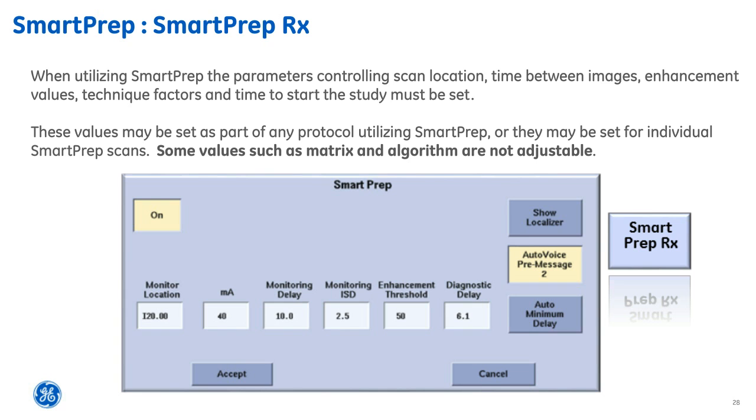So it's pointless having lots of images with no contrast in, or very low density contrast, because we're just irradiating the patient unnecessarily.